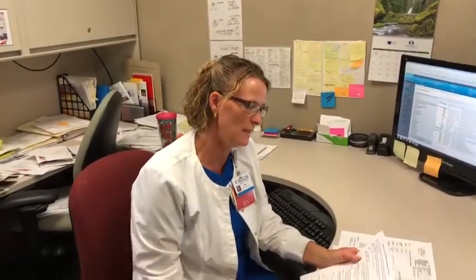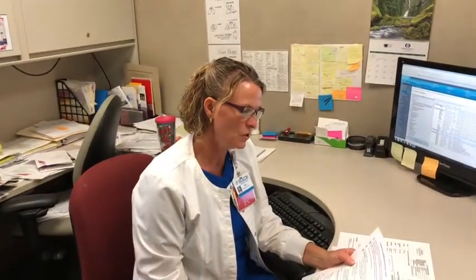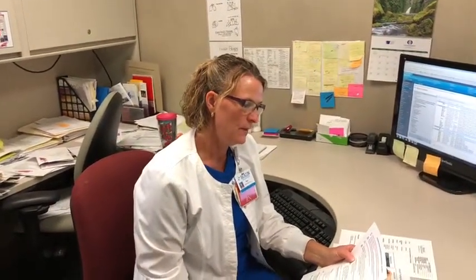Then the second question is can the patient continue the pump during ED stay? There are some contraindications. If the patient presents to ER with a diagnosis of DKA or HHS, and HHS is hyperosmolar hyperglycemic syndrome.